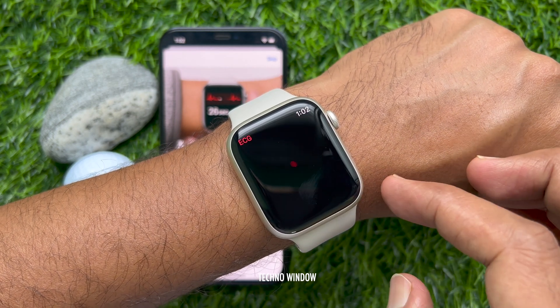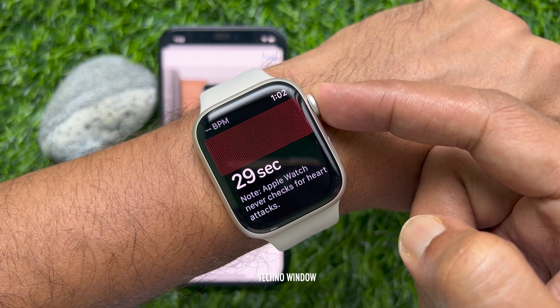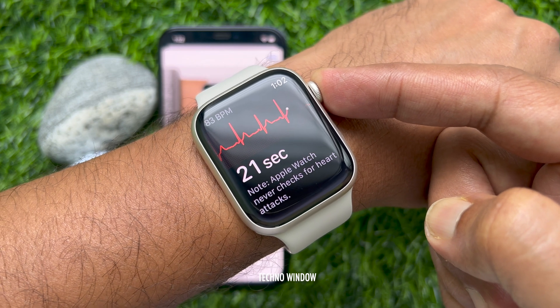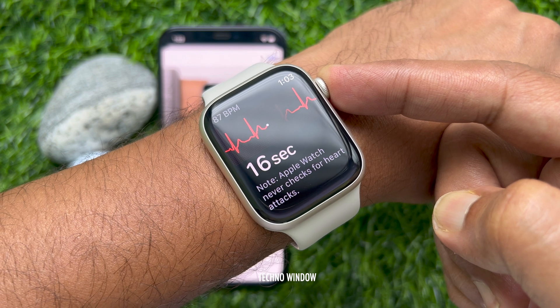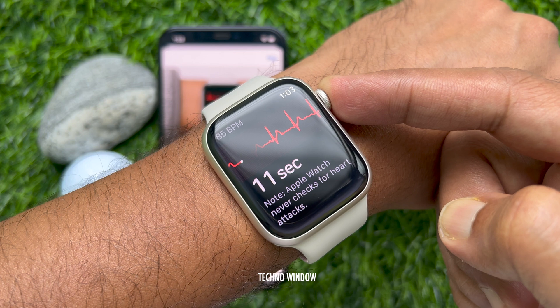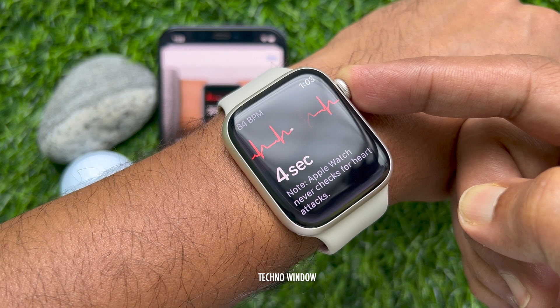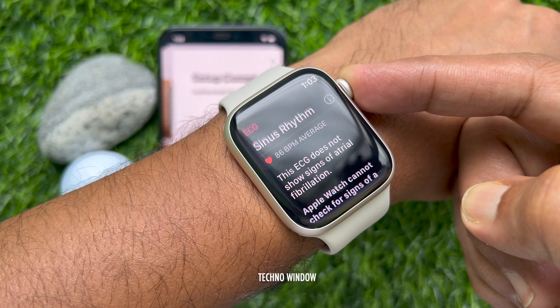Tap OK. Then hold your finger on the crown. It will start counting 30 seconds.